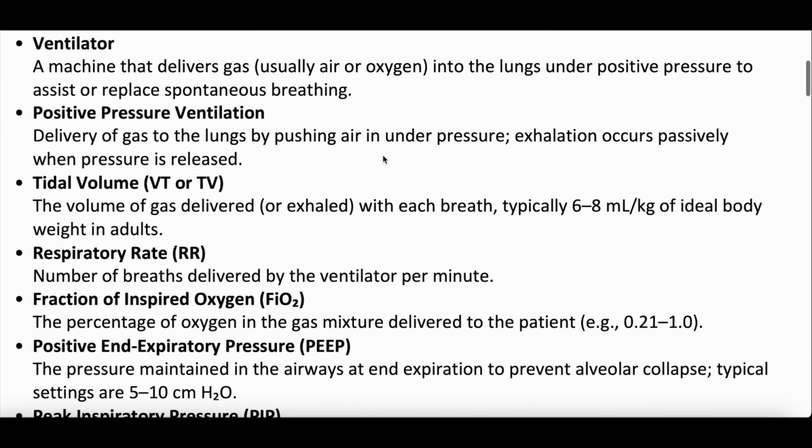In positive pressure ventilation modes, exhalation usually occurs passively. Okay, think about that. Exhalation occurs passively. So in all these modes, you provide an inspiratory pressure. Sometimes you set the inspiratory pressure. We'll talk more about that. Sometimes you set a tidal volume, but that volume, when it's being pushed into the lungs, generates a pressure. But all the exhalation that occurs happens passively.